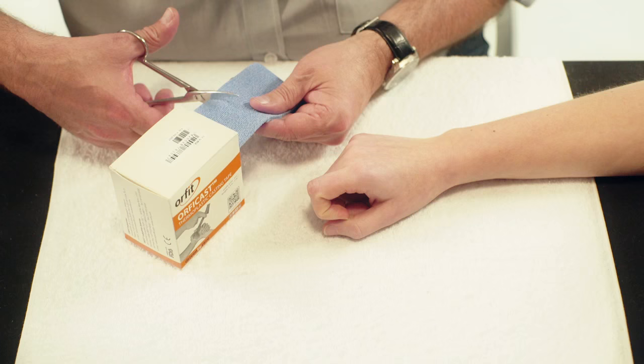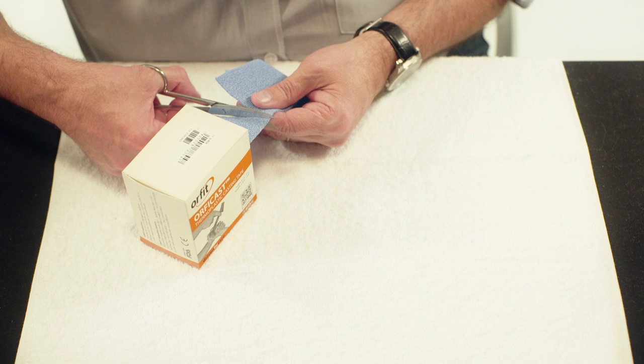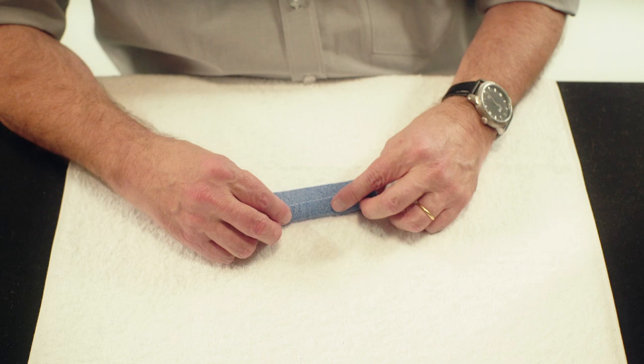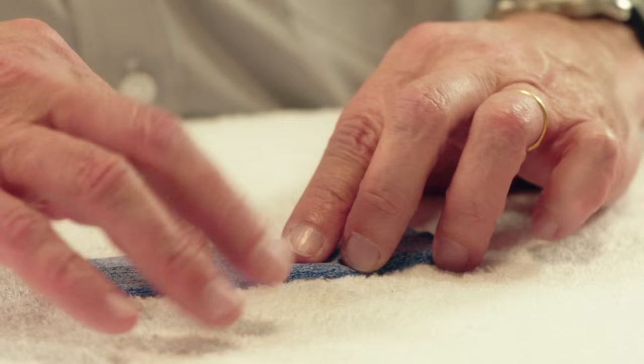Use a strip of 6 cm wide Orficast. Measure the width of the hand's MCP joints and cut the Orficast accordingly. Fold the Orficast in thirds lengthwise.